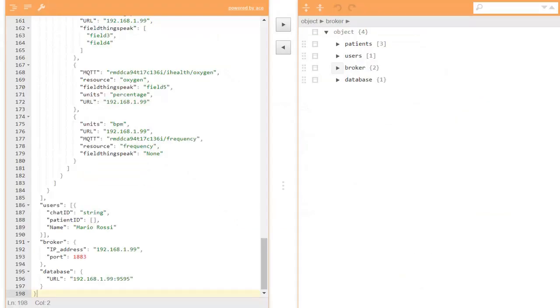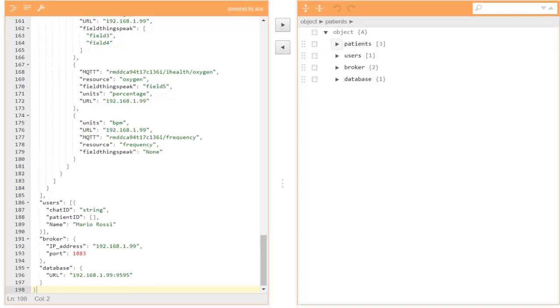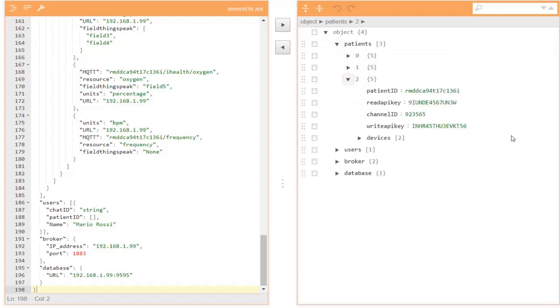This is an example of the catalog used in our system. The catalog is a JSON and the main keys are patients, users, broker and database. Patients is a list of all the patients, in which every element of the list is a single patient. Every patient has a patient ID, a read API key, a channel ID and a write API key. These last three values are used to store and retrieve data in ThingSpeak.